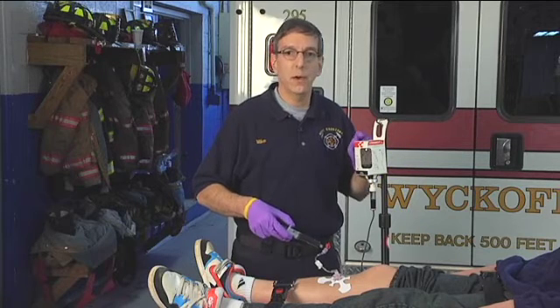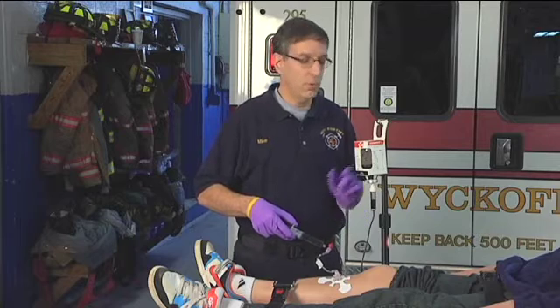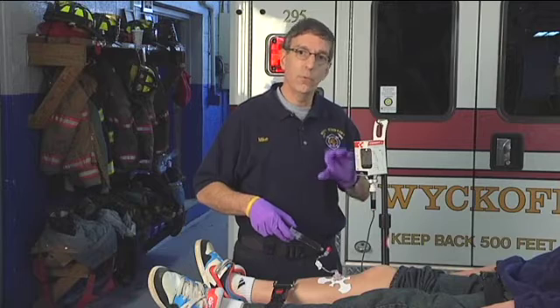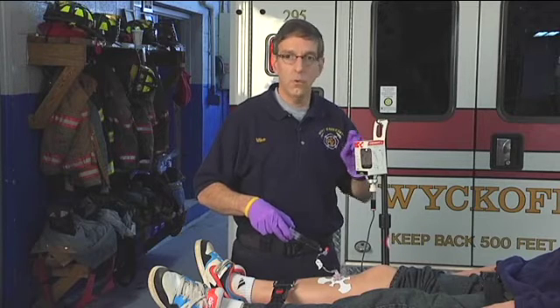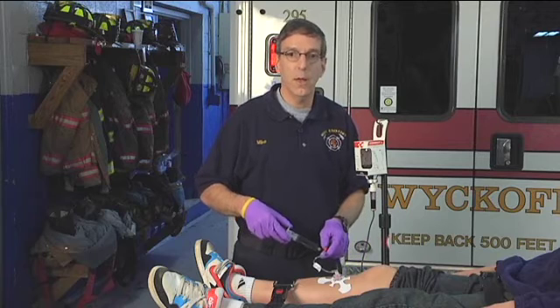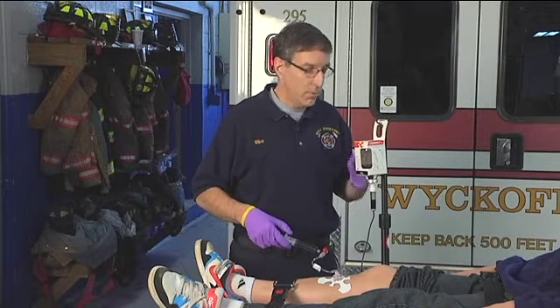Very shortly, the manufacturer will release a single-dose bottle containing two and a half plus two and a half grams — five grams total — in one bottle, so it won't be necessary to spike two bottles. You'll still need two bags of 100 mL diluent for the new container. Most of us currently carry the two-bottle, two-and-a-half-gram doses. Regardless of whether you have a peripheral or intraosseous line, a stopcock is a smart idea so you can pull medication out if it's not flowing as quickly as needed.